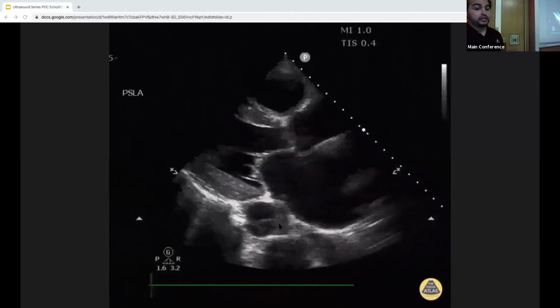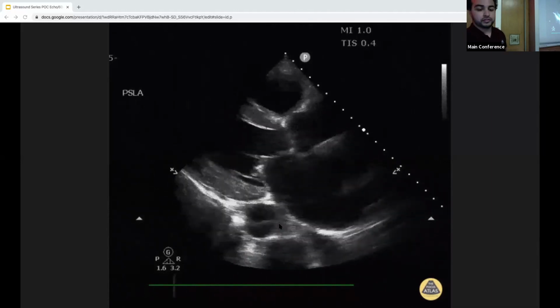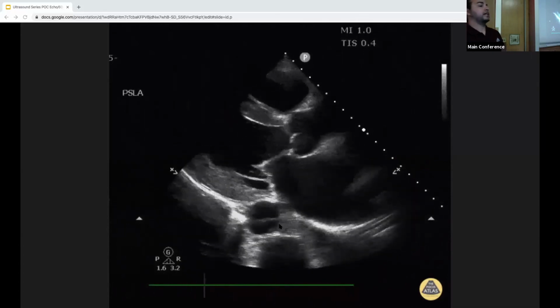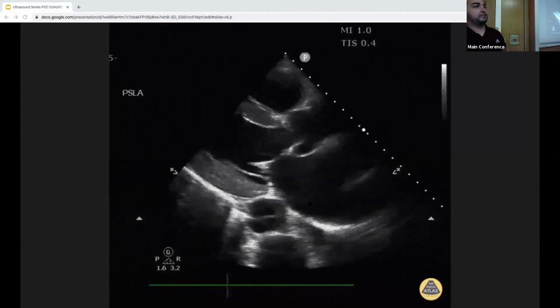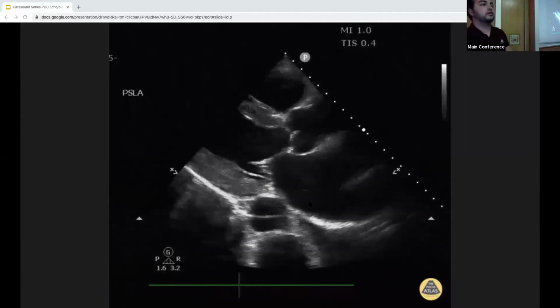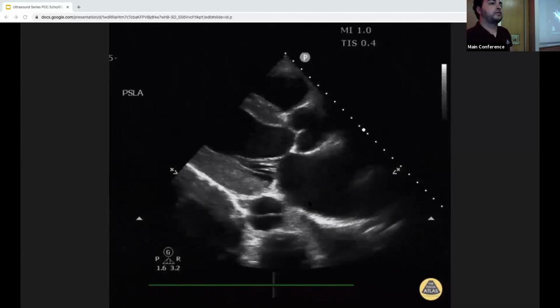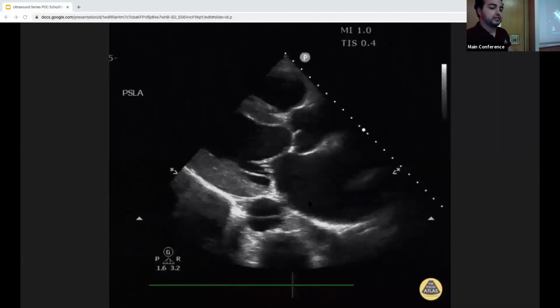Again, another plug that you should always try to get your descending aorta in your parasternal long axis. You can't tell if it's type A or B, right? Correct. It's all descending. This is just in the descending aorta, so you know it could be type B if there was no dissection anywhere else, but true, you can't tell. Would you say that the left heart chambers are also really dilated there? Yes, and the EF is reduced.